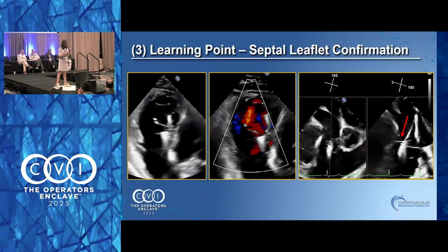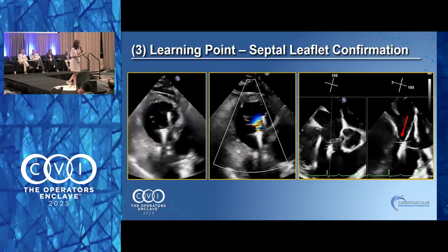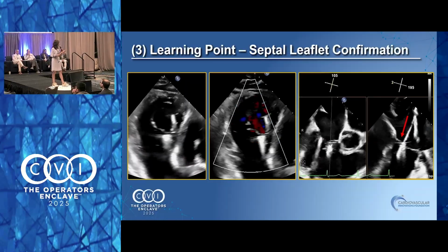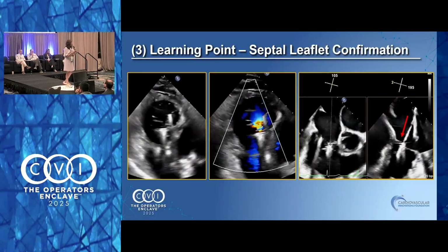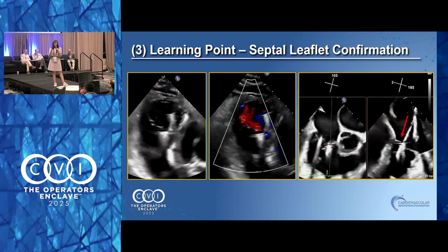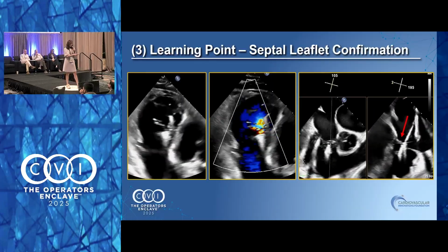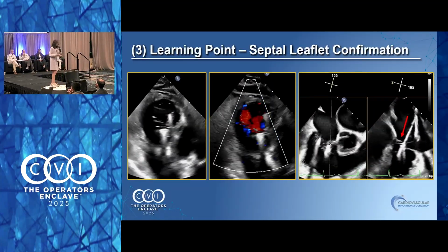And this is the thing, and you can look on the transgastric view. I want you to remember that image. Look at the gap and the color. Although it's close already, the gap is pretty big, right? Looking at the transgastric view, Paul and I always say we need at least 2 confirmatory views to make sure that both leaflets are really grasping. So in the interest of time, this is really not optimized. I think the panelists can agree with me on that.